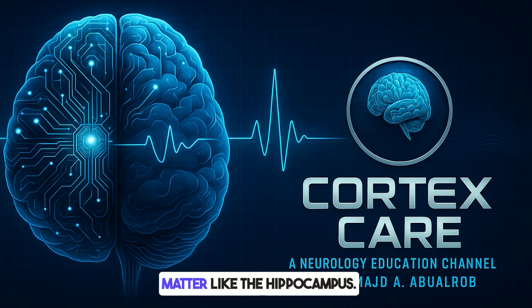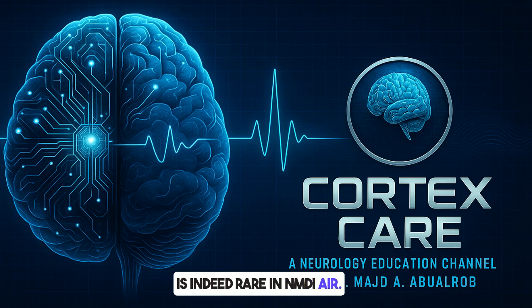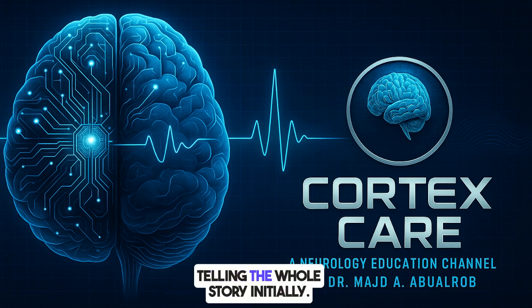You mentioned deep gray matter like the hippocampus. Is that common? I thought the paper said that was rare, compared to, say, limbic encephalitis. You're absolutely right to pick up on that. Hippocampal involvement, that T2 FLAIR brightness in the hippocampus, is indeed rare in NMDA. That's a helpful point for differentiating it from other types of AE, like LGI1, that classically affect the medial temporal lobes. Does how bad the MRI looks match how sick the patient is? Not consistently. MRI severity doesn't always correlate well with clinical severity, especially early on. It's almost like the scan isn't telling the whole story initially.